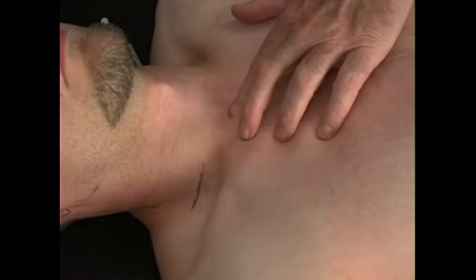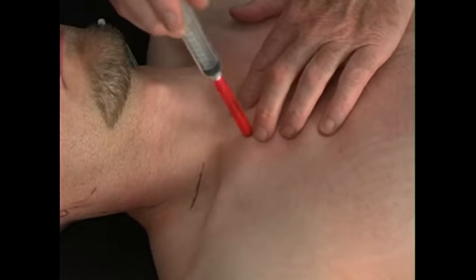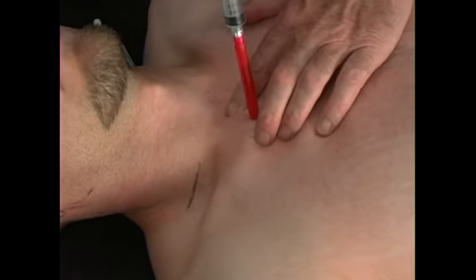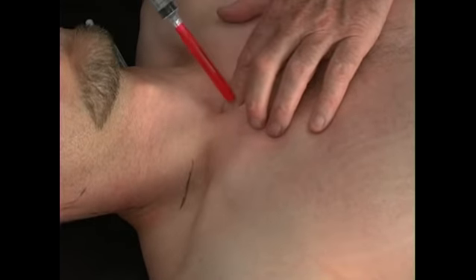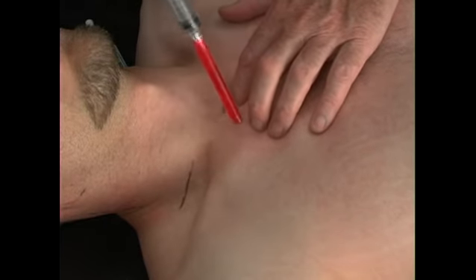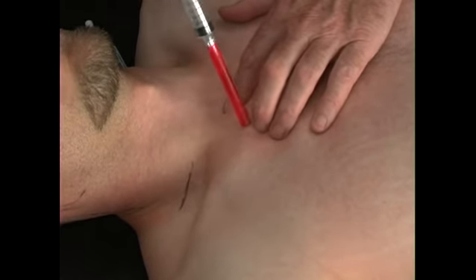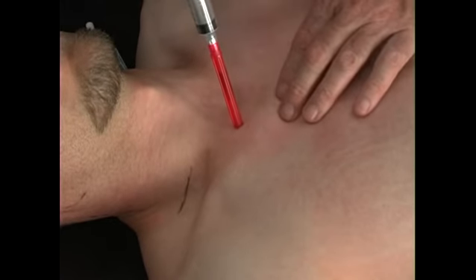And so we can lock our fingers on it. It's not necessary to get into the joint itself. We really want to inject all around the joint with our solution onto the first rib, then medially into the tender areas all around the joint. Again, if this is a meticulous injection, it works best. If you do happen to get into the joint, that's fine, but remember that the capsule surrounds that, and we're probably getting solution in the joint by coming into the capsular area around it.